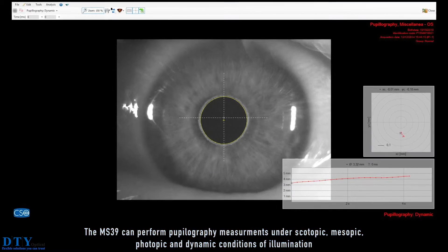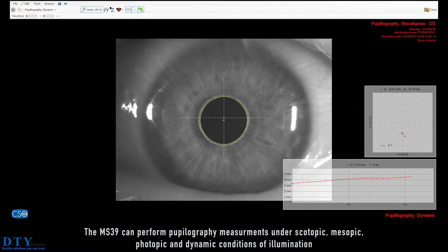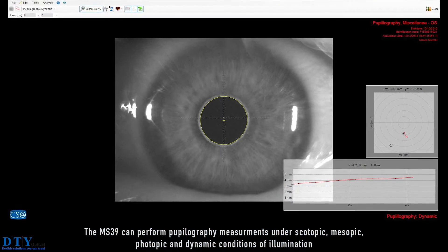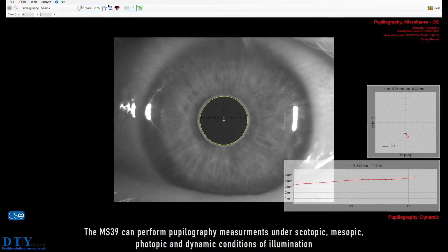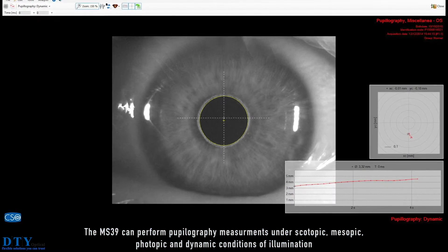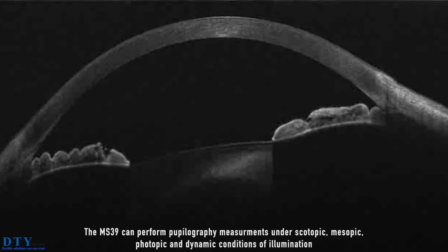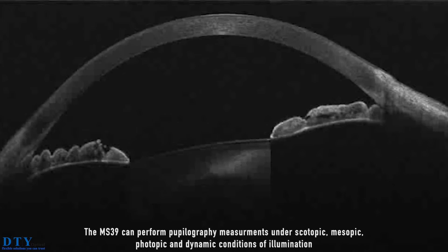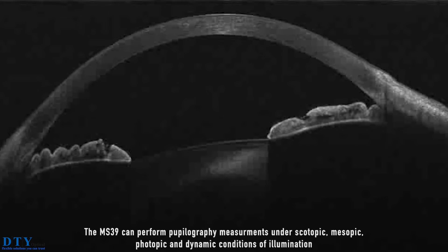The MS-39 can perform pupillography measurements under scotopic, mesopic, photopic, and dynamic conditions of illumination.